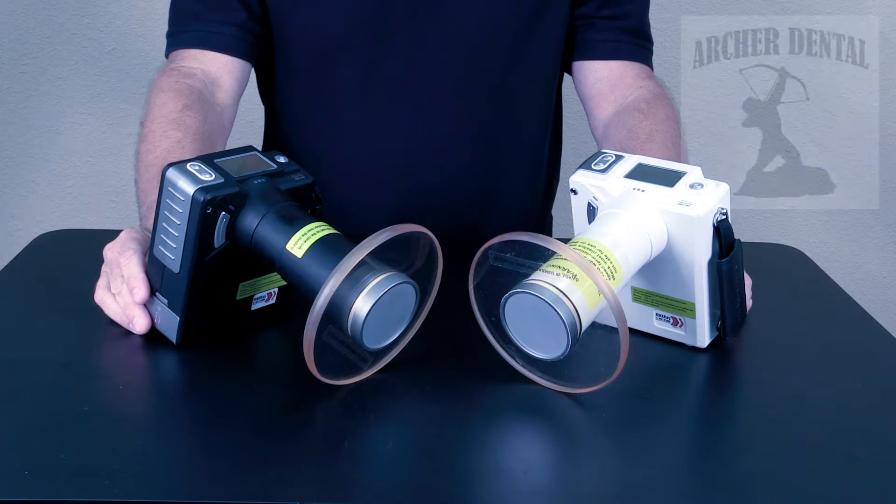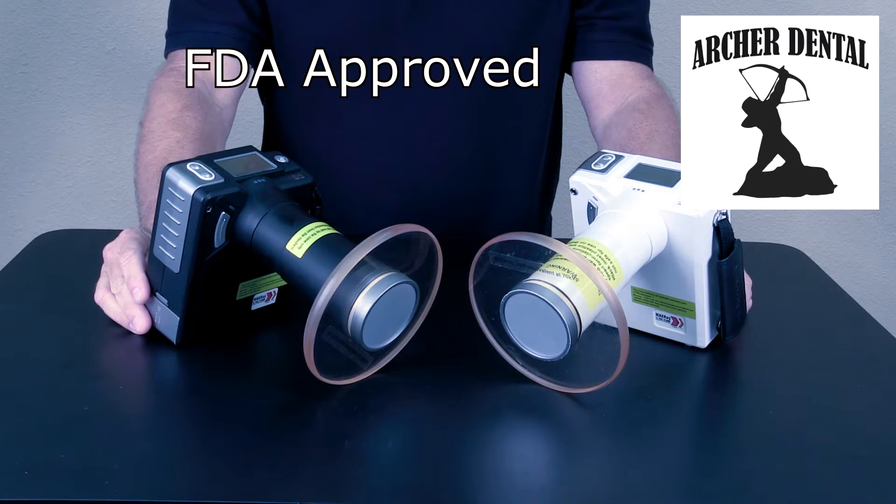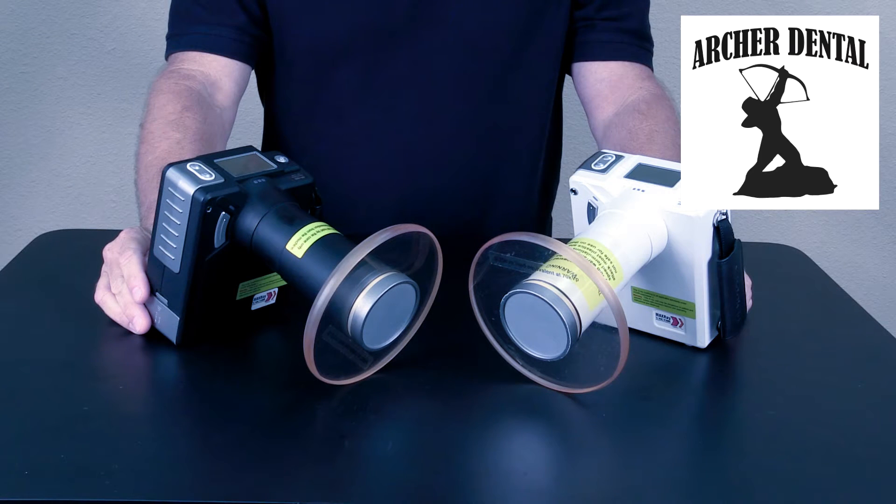Today we have the Vector MaxRay. Over 20,000 units are in use worldwide. This unit is FDA approved for handheld use. The unit comes in black or white.